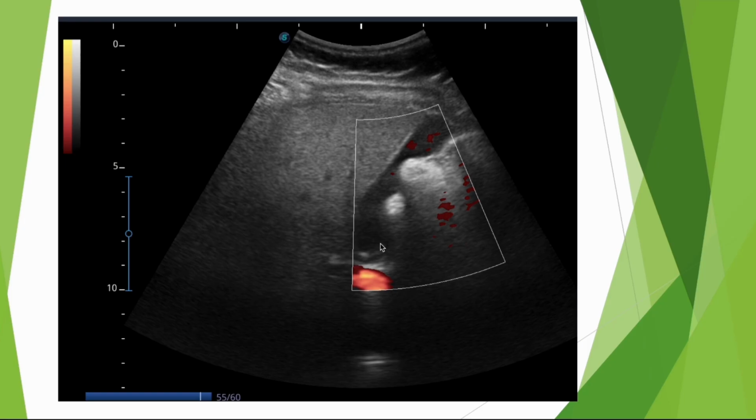But listen, ma'am, you have two large gallstones in your gallbladder. We need to schedule surgery because that's why you're in pain. The stones are probably getting stuck. And that's absolutely not the case here.